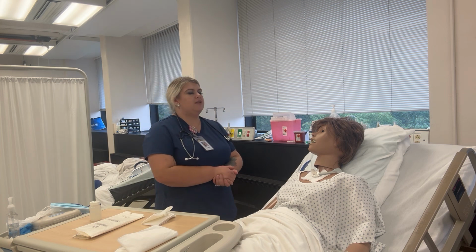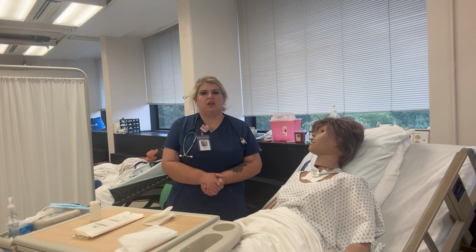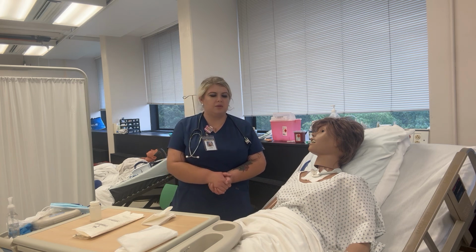Again, we're going to assess the patient for pain. The patient denies pain at this time. So we want to go ahead and jump into a respiratory assessment. Anytime we do suctioning or any kind of trach care in a patient, we want to do a respiratory assessment.